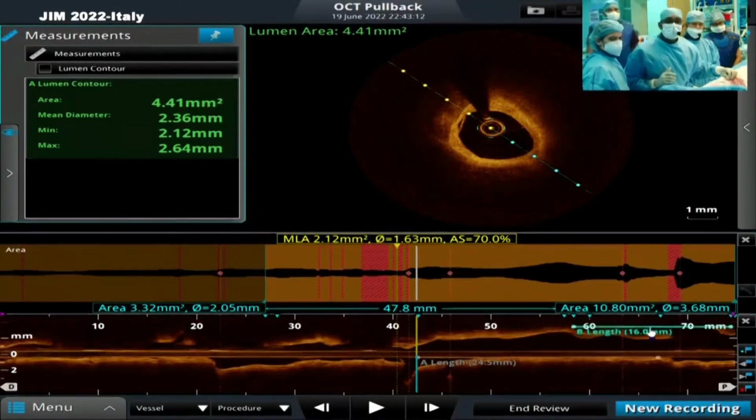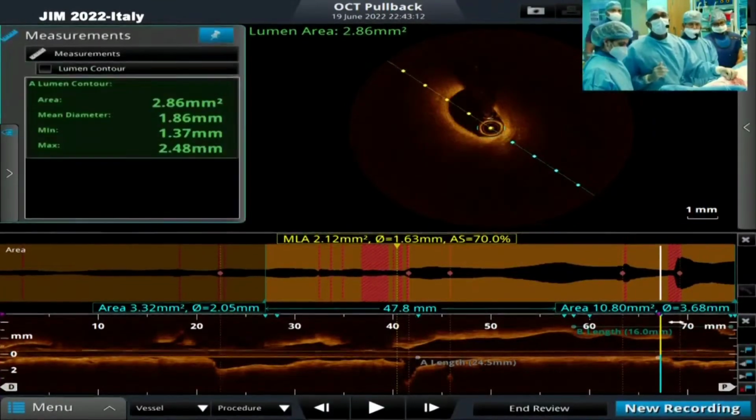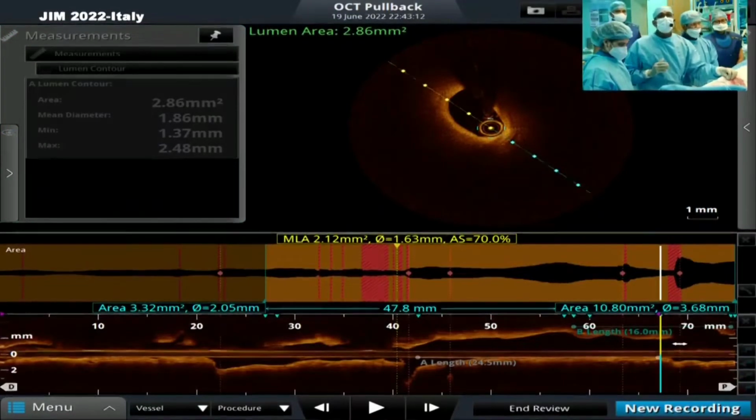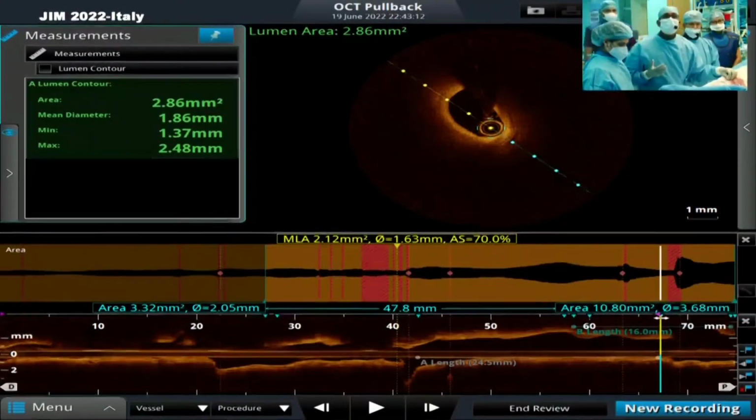Deepak, what was the left main diameter? It was 4.5. So we are going with a 3.5 Alpine stent. A 3.5, definitely you would be able to go more than 4.5. So that was the reason why we decided on a 3.5 stent. So what is the other panelists' opinion?